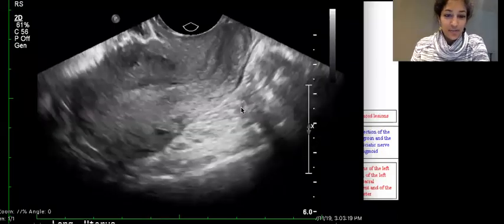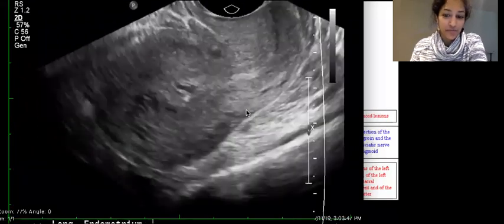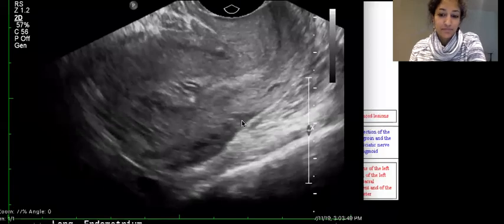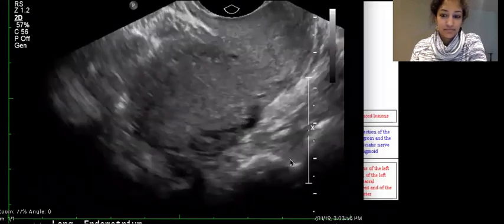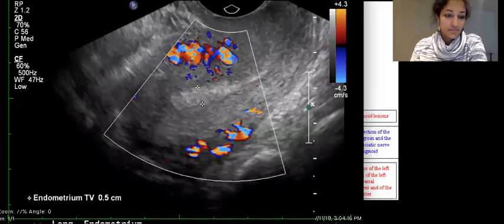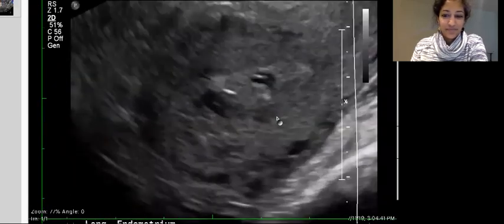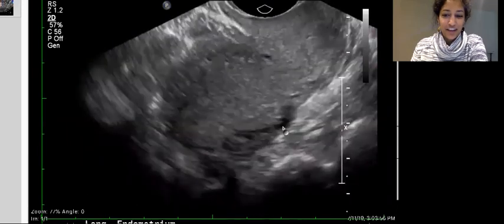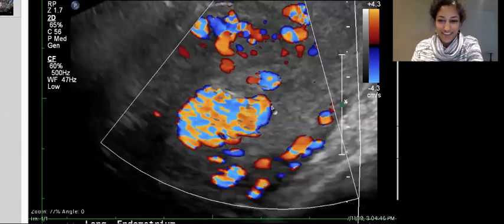Okay, so this was a patient who had had a D&C 2 months prior, and she was still bleeding. Anu is asking for Doppler, which I've got here. Yeah, so she's guessing an AVM, and I haven't even gotten to the more dramatic images yet.